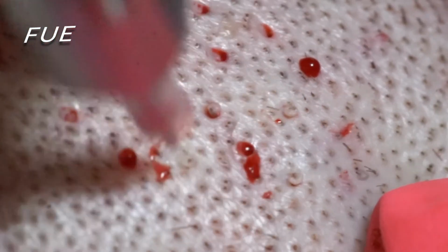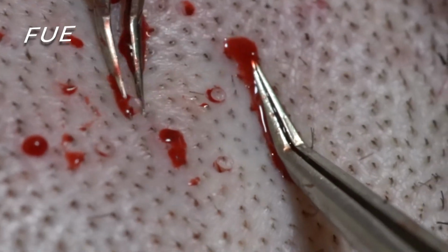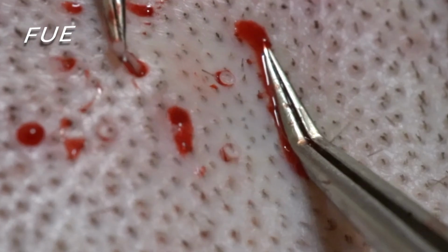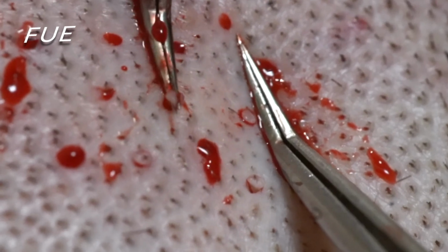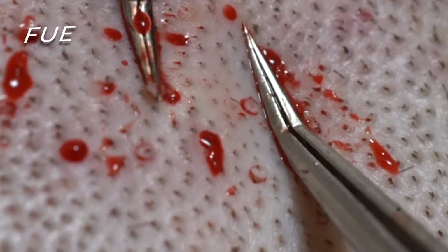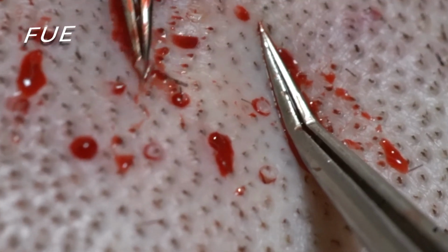Now we're going to move to the second part of FUE, and it's using the tweezers to pull these grafts out. Now this is the part where it gets a little traumatic. You can see we're pulling on this hair, you can see the skin coming, and then we just saw a pop. We're going to try to go back and get this hair again, and we're pulling, and as it comes out, you're going to notice that this hair is almost completely stripped of the tissue around it, including the oil glands and the follicle. It is not usable.